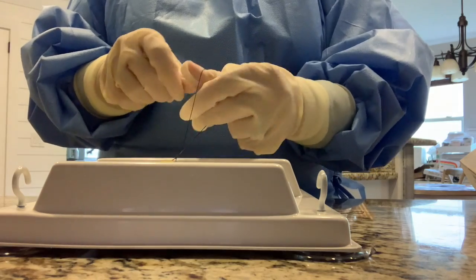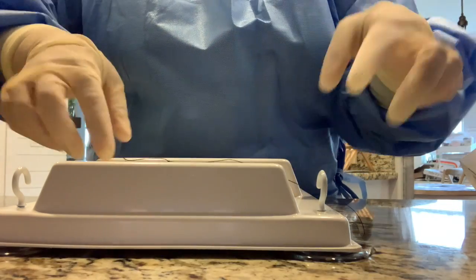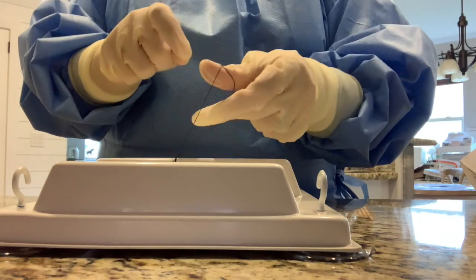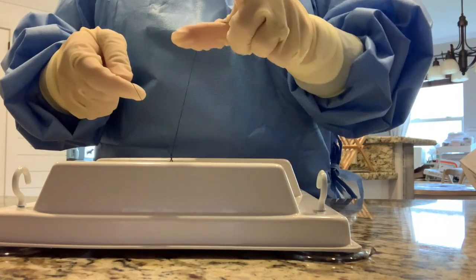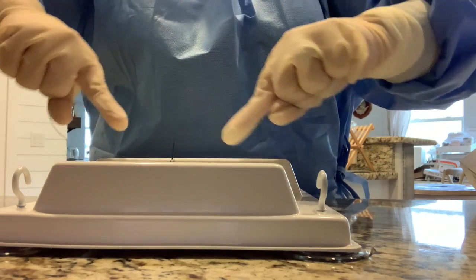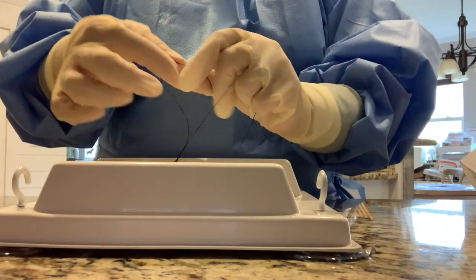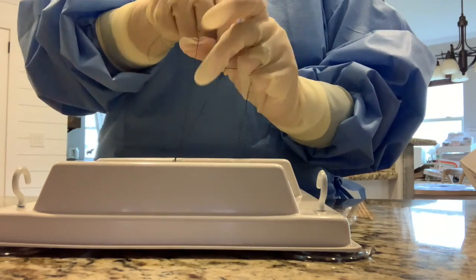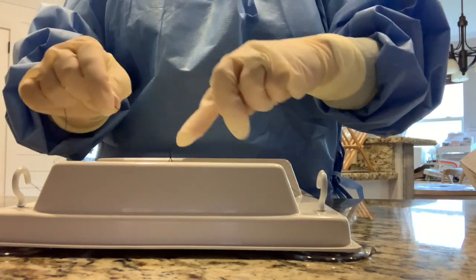You just repeat that: loop it with your thumb, make your loop, go through, bring it through, and as you go down make sure you're crossing so they're nice, stable knots. Through your thumb, make your loop, bring it through, cross down. Make your thumb loop, bring it over, go through. Your thumb loop, over, bring it through, through your thumb loop - cross it over. See how they're nice and stable knots.